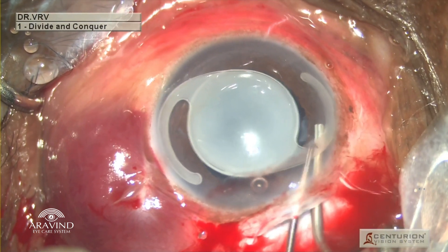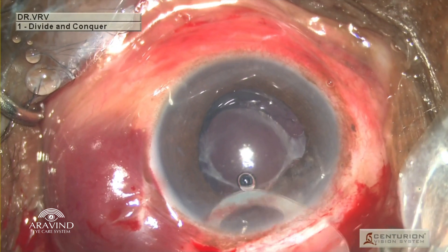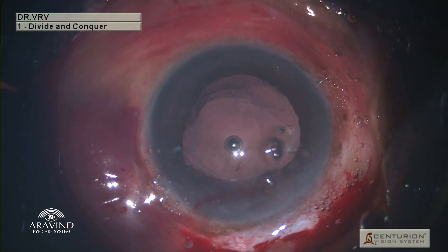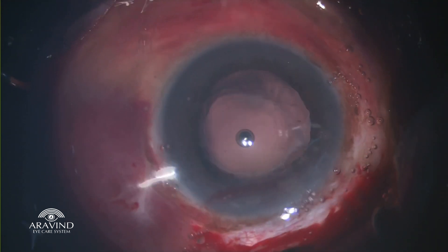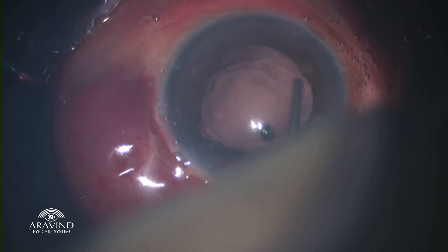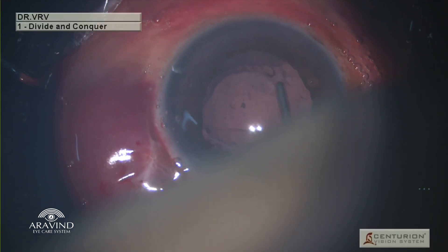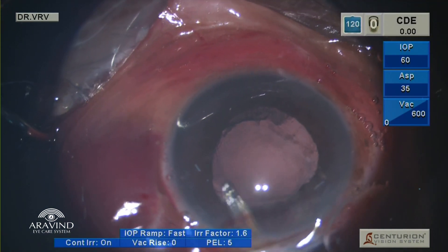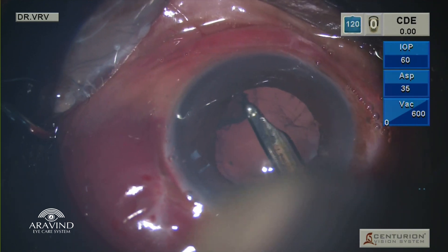Using the Sinski's hook above and the viscoelastic cannula below, the IOL was explanted from the eye. The explanted intraocular lens was totally opaque and white — fibrous PCO in the mid periphery and pearly PCO at the equator was noticed. Using a hydro cannula, posterior capsular polishing was done very slowly. Once polishing was completed, using a Simcoe cannula the released PCO was aspirated.